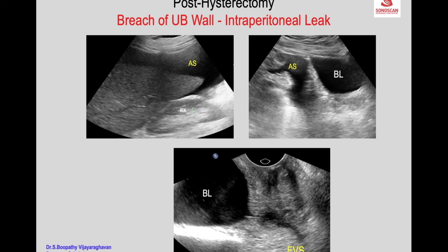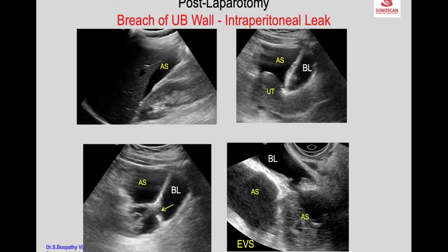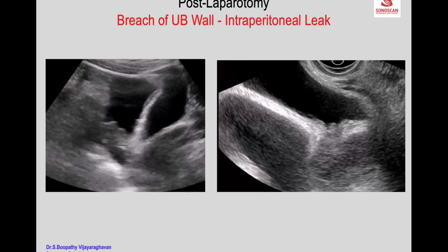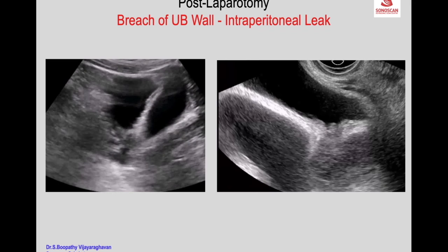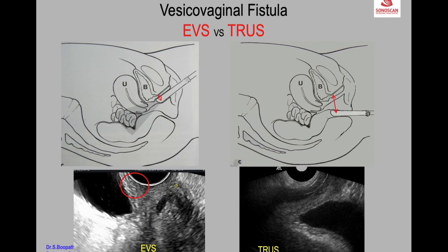The bladder shows general ascites, and in the pouch of Douglas you see the rent in the posterior wall of the bladder. The injury to the bladder was not seen on abdominal scan but is seen on transvaginal scan. In real time, going laterally, you can see the rent more clearly — the distance between tissues is appreciable.